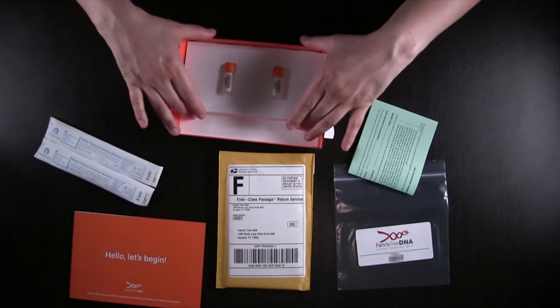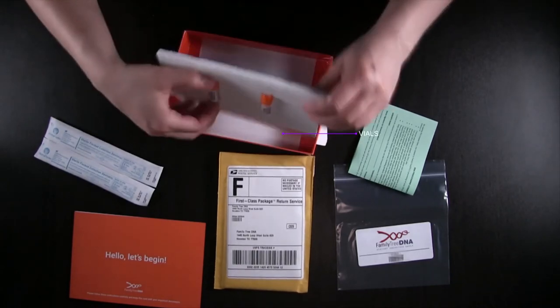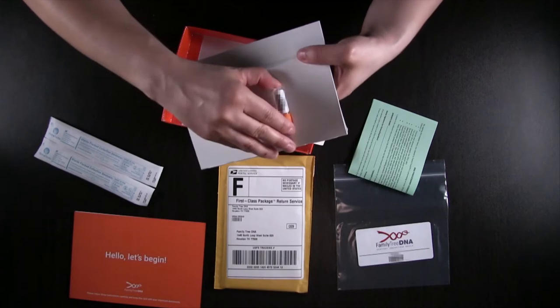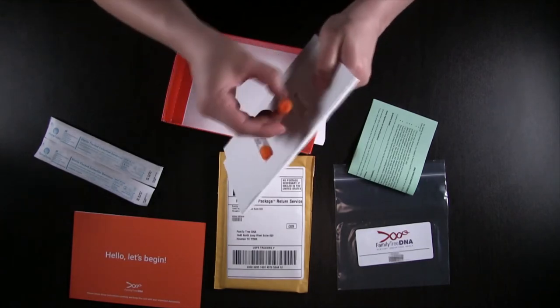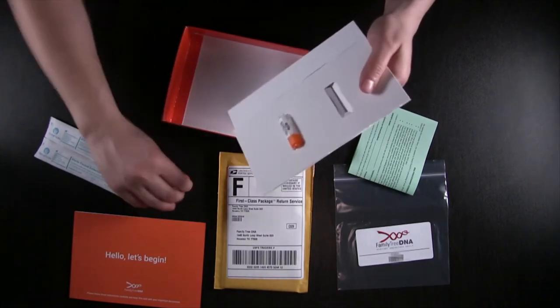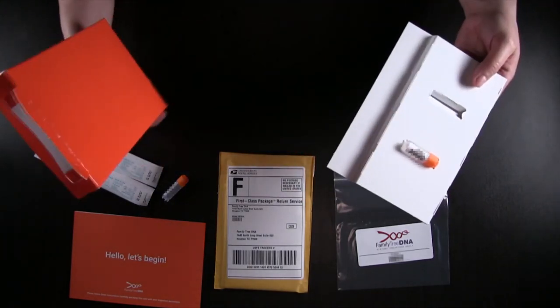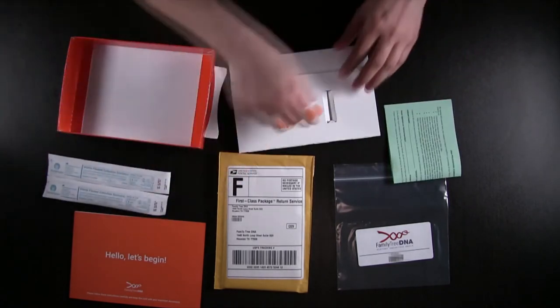Here we go with the little vials. They were super tough to get out of, so it was well packaged — this was really hard to get out. Finally did it. It's got a little liquid in it. And that's it. So this is what you get in your Family Tree DNA kit.